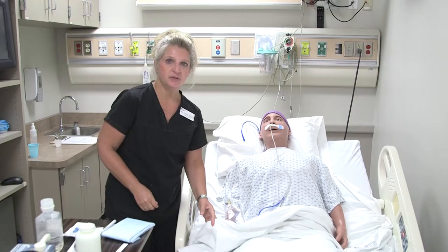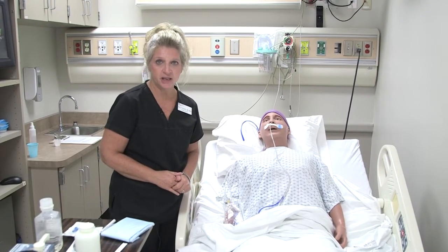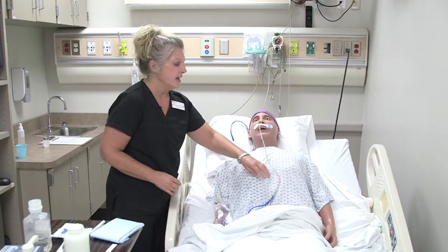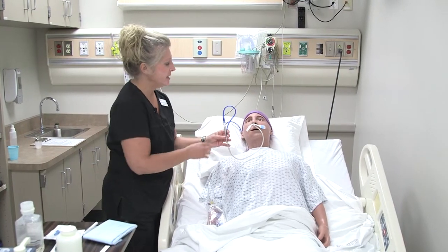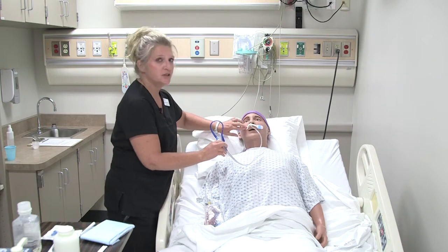This skill is going to focus on how to provide a patient with enteral feeding. This particular patient has an NG tube in, and this is a Salem pump tube, but it can be utilized for tube feedings as well, especially when the tube feeding is short-term.